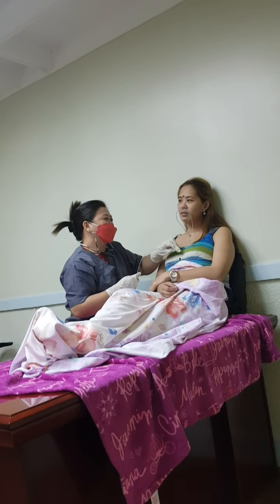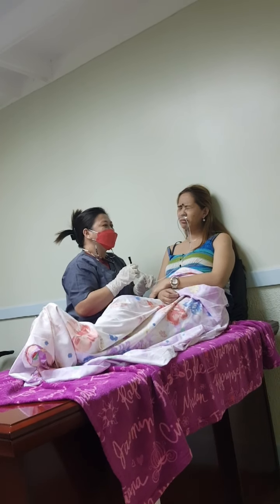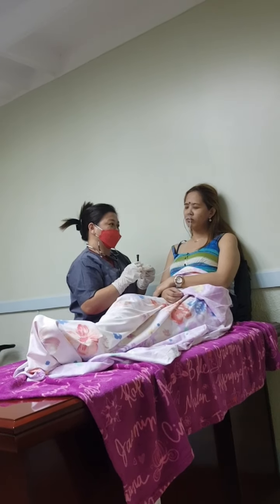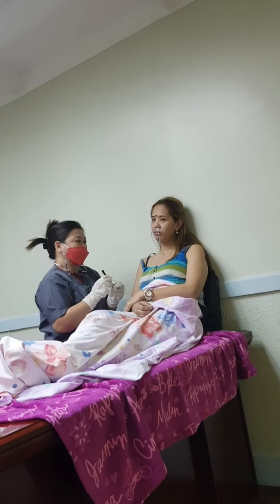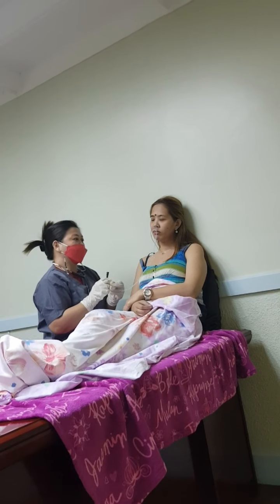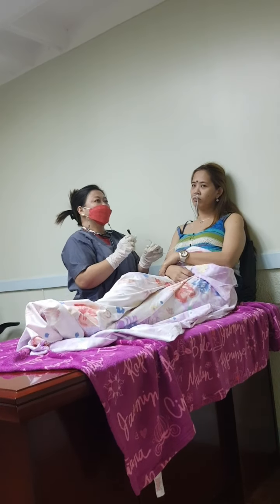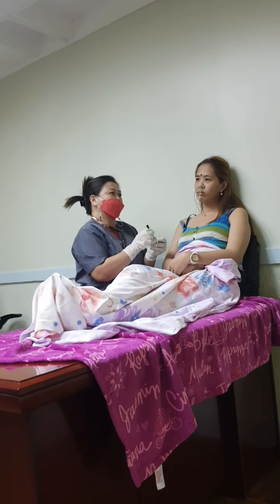Do not use force to rotate the tube if it meets resistance. Forcing the tube may injure the mucous membrane. Discontinue the procedure and remove the tube if there are signs of distress, such as gasping, coughing, cyanosis, and the inability to speak or hum. The tube is in the trachea if the client shows signs of distress and is unable to speak or hum. While keeping one hand on the tube, verify the tube's placement in the stomach.